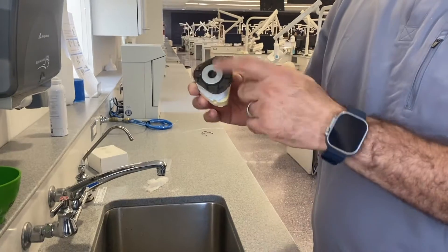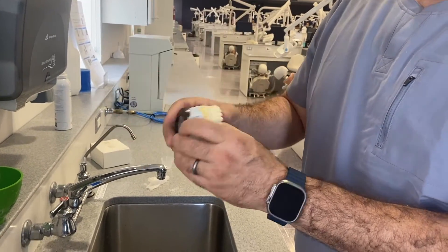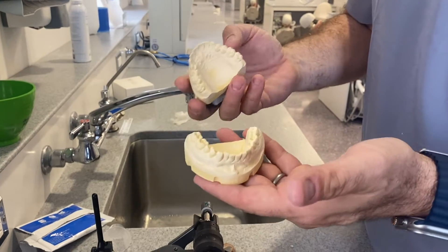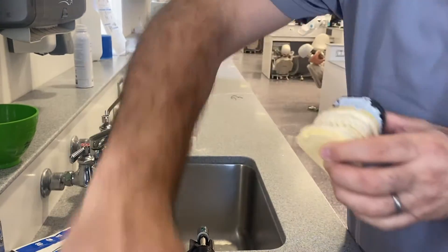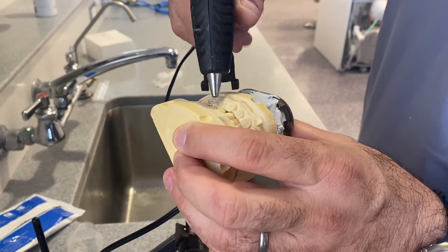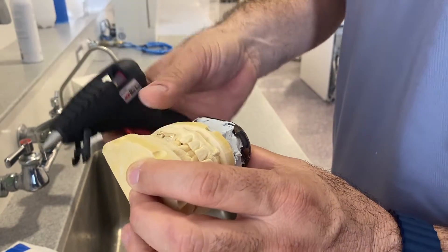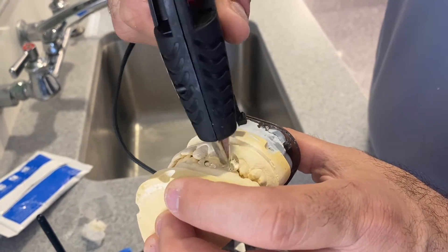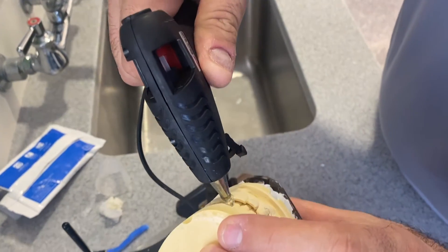Now we have the upper with the base already mounted. We're going to make it pretty later on. With both casts dry, I'm going to put them in MIP. I'm going to grab my hot glue gun and hot glue some areas — one area there, one area there, and maybe a little bit right here in the anterior.